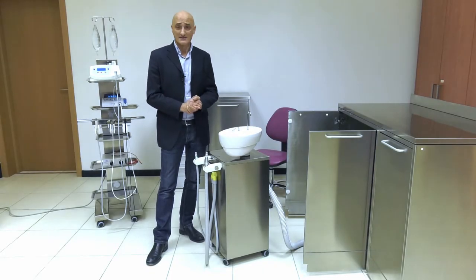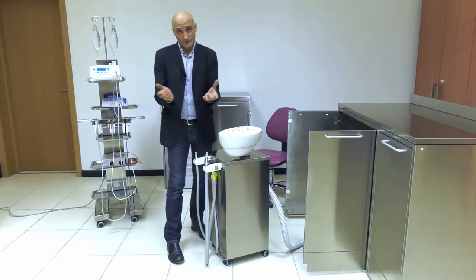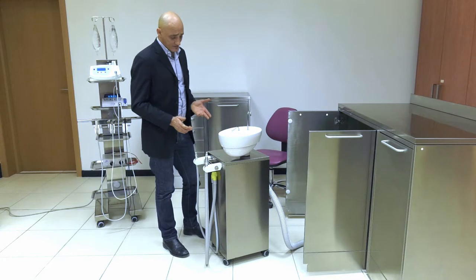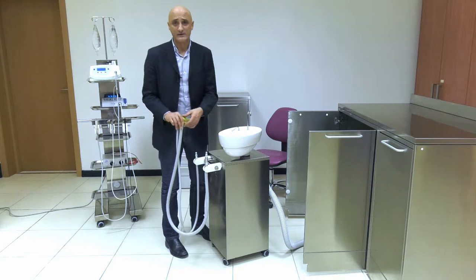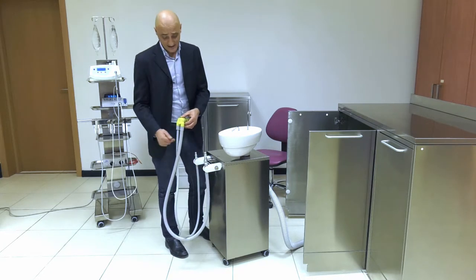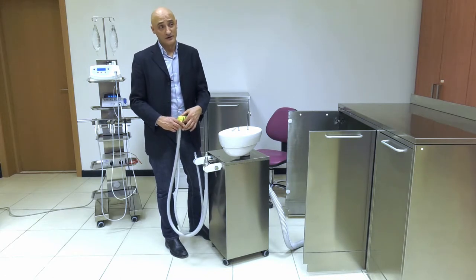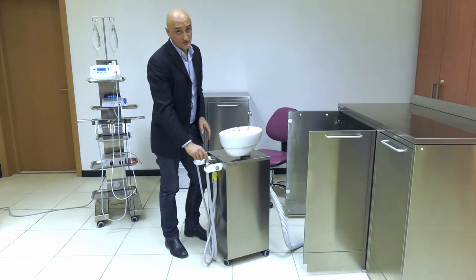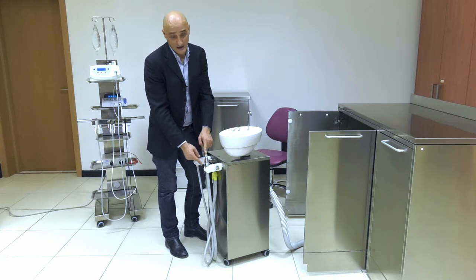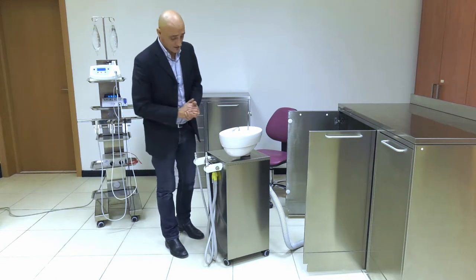As regards maintenance, servicing our Aspirol cart requires two very simple steps that are no different from the operations you carry out every evening on your standard unit. The suction waste filter must be cleaned every evening. The O-rings must be thoroughly lubricated, and the same applies when taking apart the two suction cannulas — O-rings must always be lubricated.